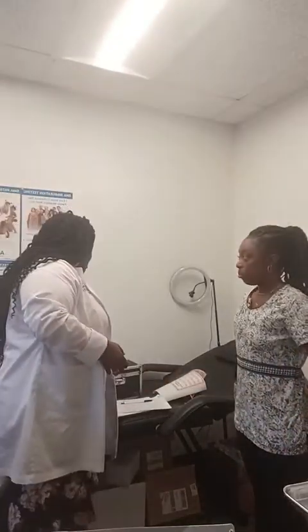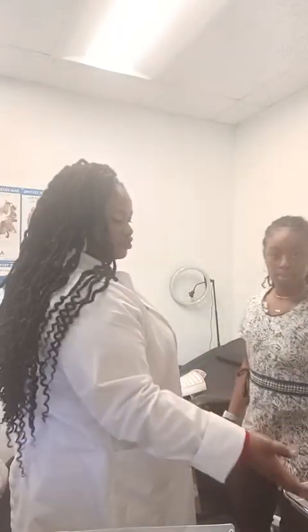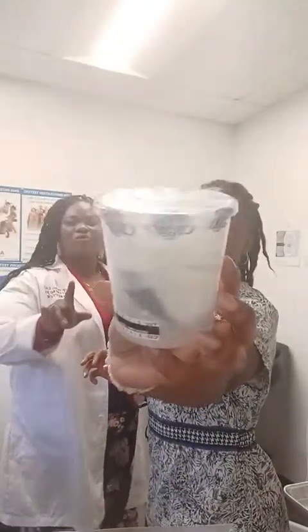All right, Isabel. Now I want you to select your cup. Go ahead and select your cup. Can you show them that the cup is untampered with? It's not open, it's sealed. She would need to break the seal. Always make sure your donor breaks the seal.